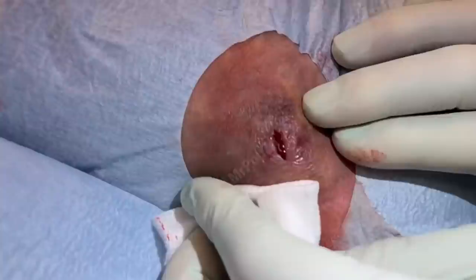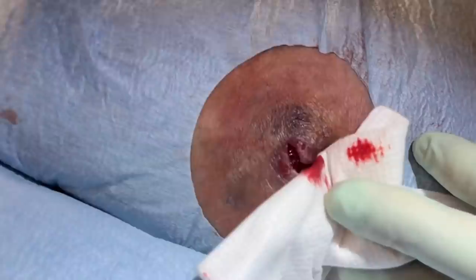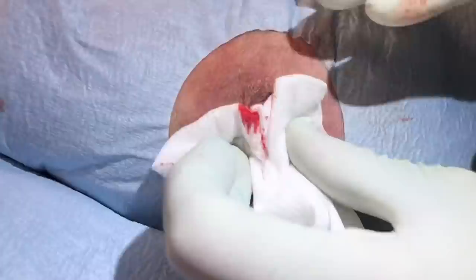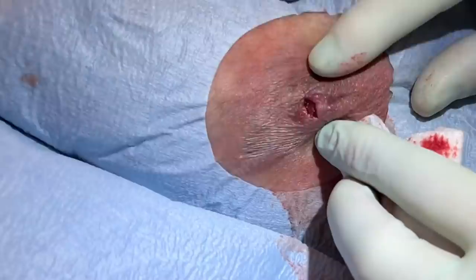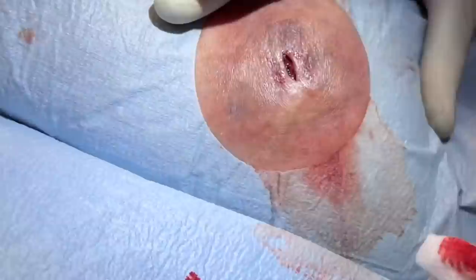That can happen when we get just a little localized bacterial infection, and there wasn't a lot of purulence either — I didn't see a lot of pus. This tissue just kind of goes sideways; it doesn't go down in there because there's pretty dense breast tissue and fat tissue underneath. It just lifts up the skin and gets real thinned out like that. So we'll put a pressure bandage on here. We didn't get much cysts — we just got a lot of fluid, which was likely causing the discomfort. After we get this to go down completely, we'll come back and start feeling around. If we feel a small cyst, we may do an excision because that could be the conduit of what's causing this to get pretty inflamed over and over.